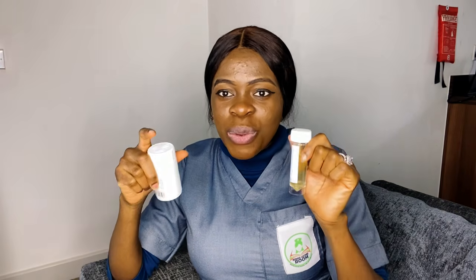One is having HCG in it. I don't know which one yet. Could it be this one or this one? One is having HCG in it, which shows that the person is pregnant. One will show that somebody is pregnant, while the other will show that the person is not pregnant. So for those that are my clients, wait till I do your pregnancy test and find that out.